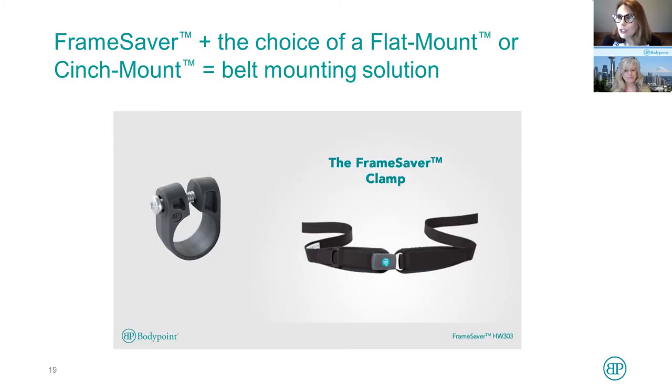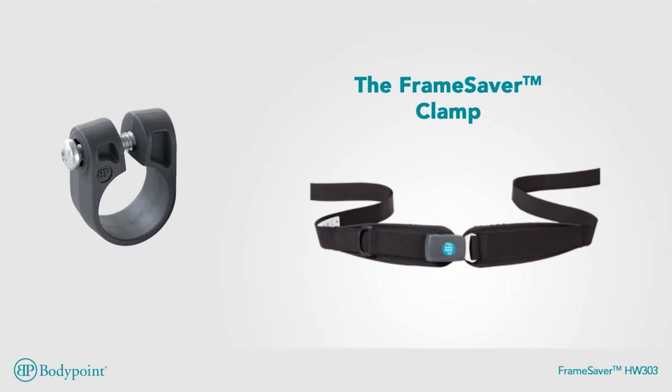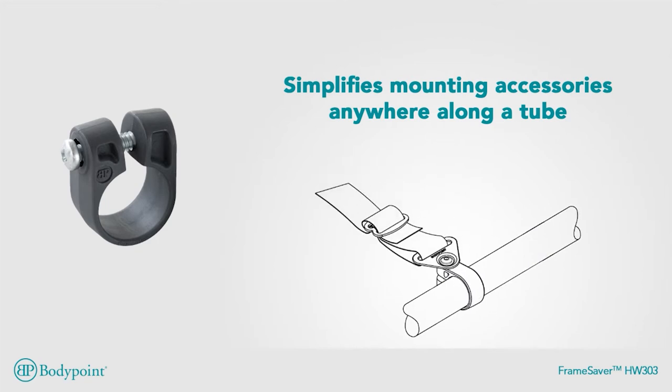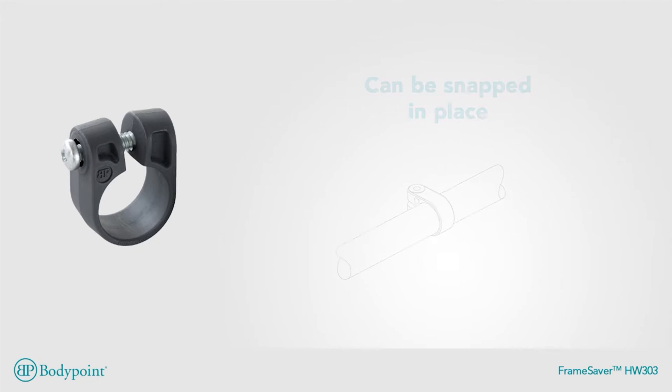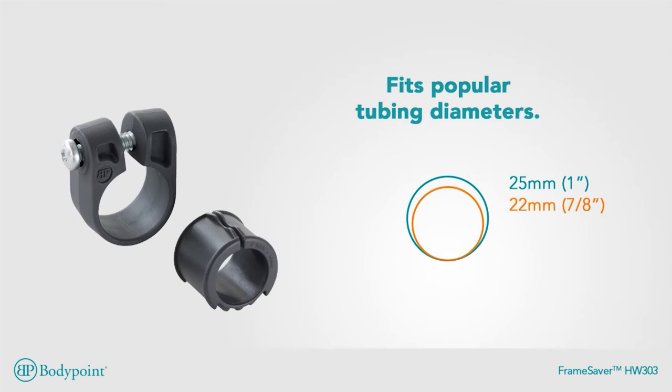But then wheelchair manufacturers started changing things. Let's look at this video and see how the frame saver is attached and how it works. With the frame saver clamp, belt mounting is a breeze. Incredibly strong, it simplifies mounting accessories anywhere along a tube without drilling a hole in the wheelchair. This super-tough nylon clamp can be snapped in place and tightened securely, but will not damage tube finishes. It fits popular 25 millimeter tubing and includes a 22 millimeter shim. A 19 millimeter shim can be ordered separately.